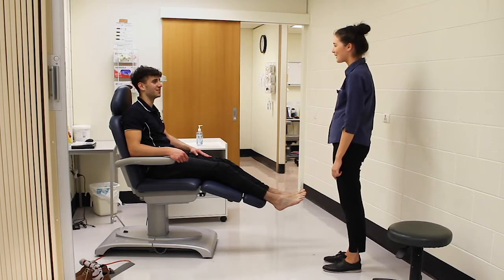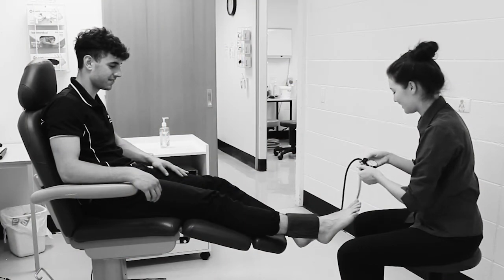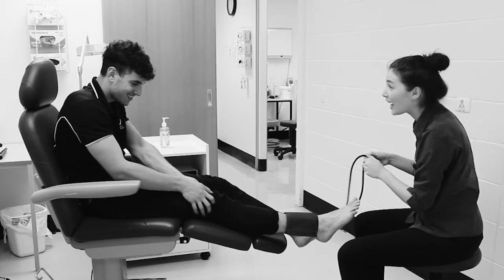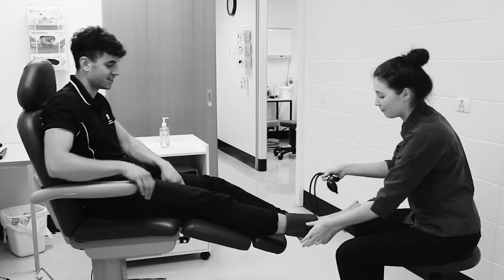Consider the following safety precautions. Do not attempt if the person has significantly reduced blood flow or low blood pressure. Do not place the pressure cuff over or near an open lesion. Do not continue a test if the person complains of pain or discomfort from the cuff.